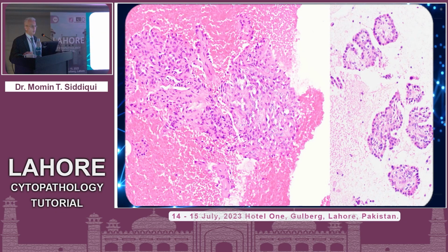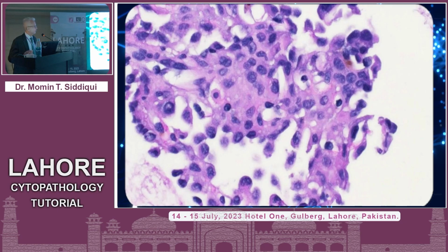This is the cell block. So again, it illustrates the vascularity, somewhat of a hint of hyalinization there, but cell types are more or less the same. Another cell block area, distinct groups there. Highest magnification for the non-believers.